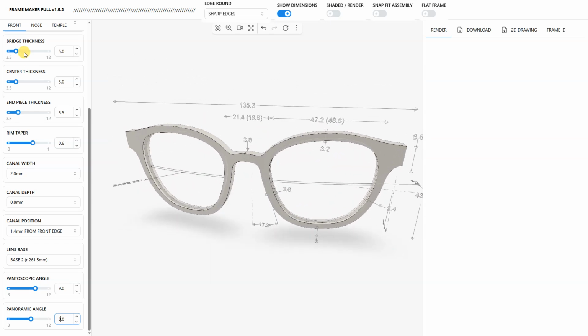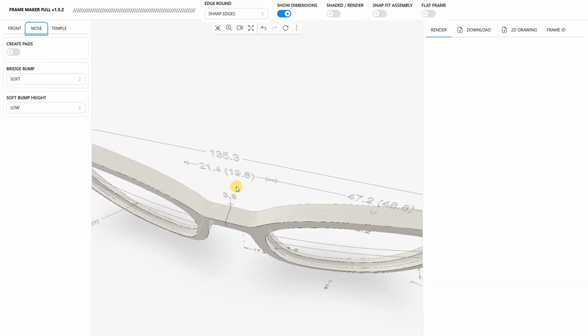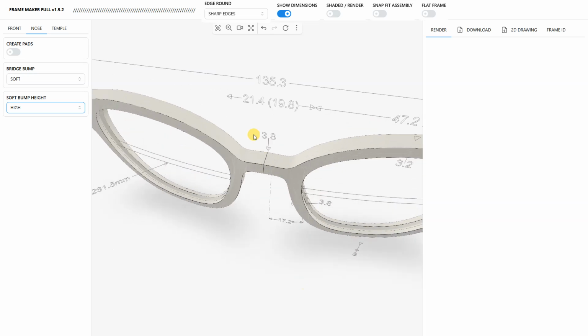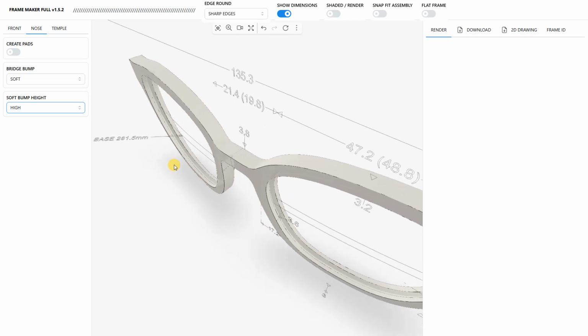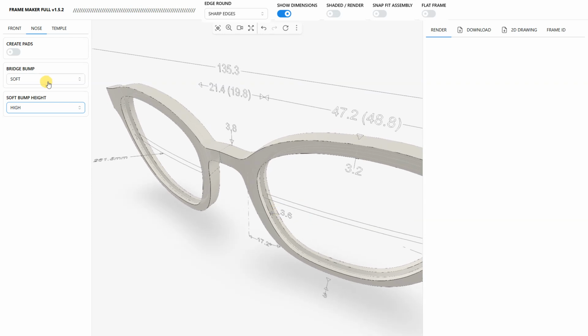So yeah, that's it for these front configurations. In the nose, we can add this to the front actually, which is the bridge bump. We can, without considering nose pad, let's just go to the bridge bump, which is a soft bump. There is no bump here; it's just soft and smooth, and we can tell it to be higher or lower. This is totally arbitrary. There's no distance in this bumping more or less. It's mainly aesthetic because if you are doing acetate, of course, this is going to be resolved by heat bumping with your tools. This is not going to have any relevance in 3D.